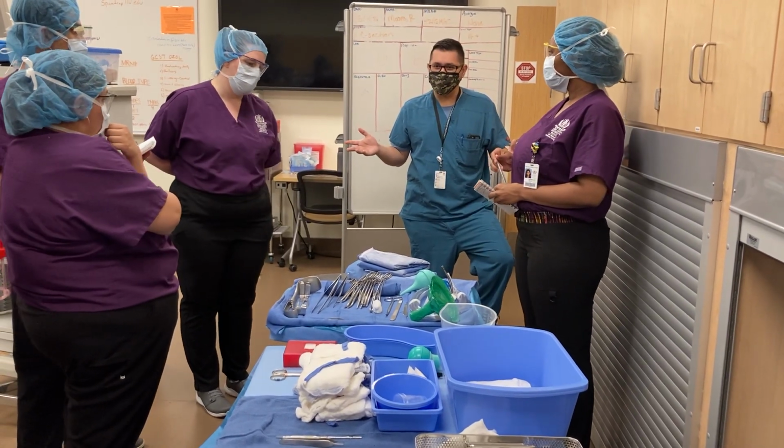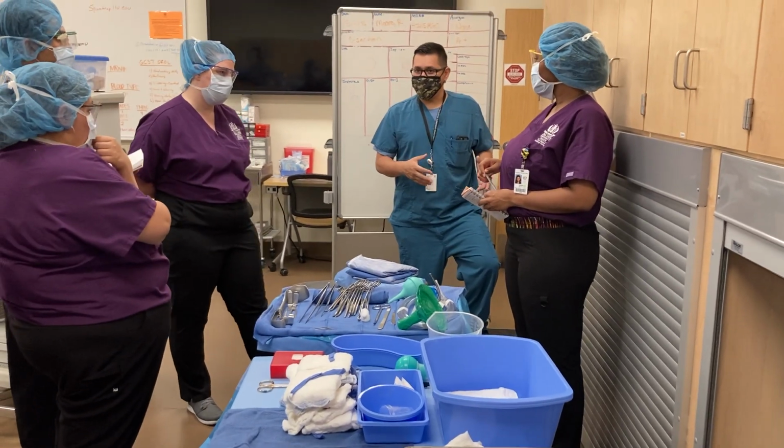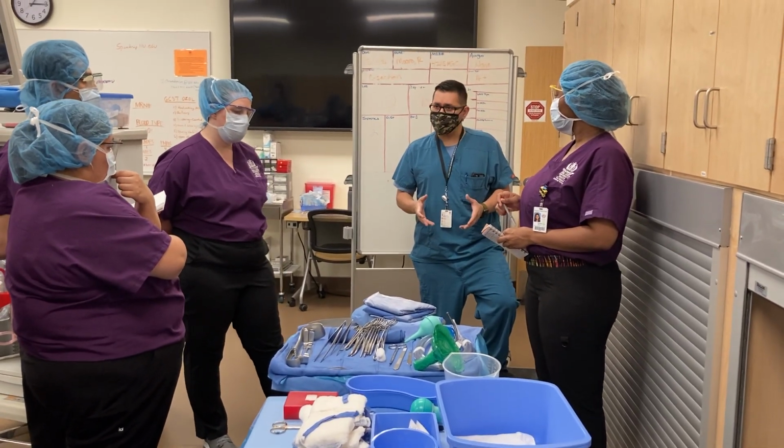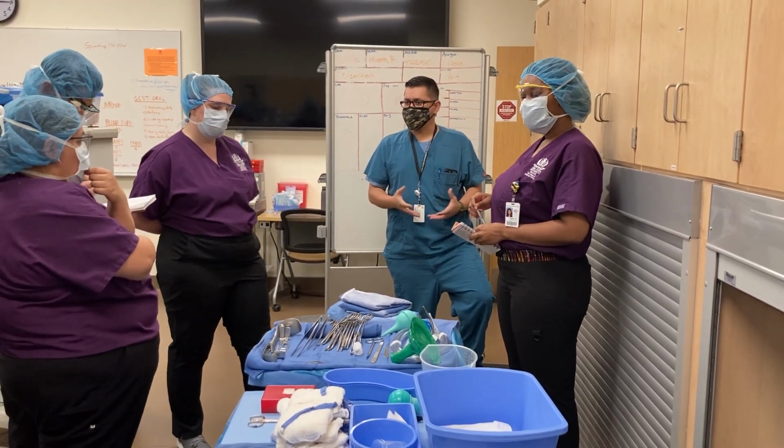The bladder blade. What are we doing again? We just talked about the anatomy, and now we know that there's a bladder blade to the Balfour, right? Yeah, so can you use the bladder blade that's here for the retraction of the bladder?